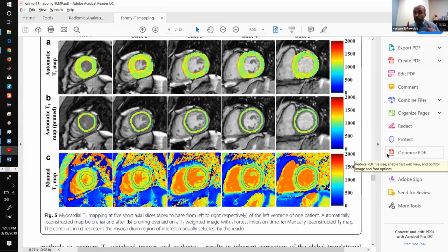However, the initial network that we used here was pre-trained from our previous work on LGE, where we segmented the myocardium and the LGE in LGE images. So we started from a very good initial weights of the network.